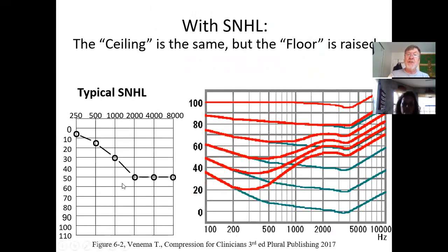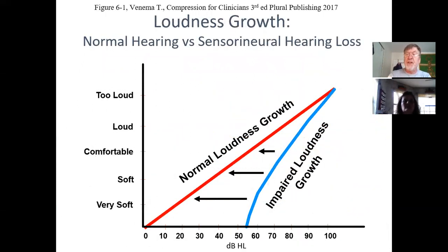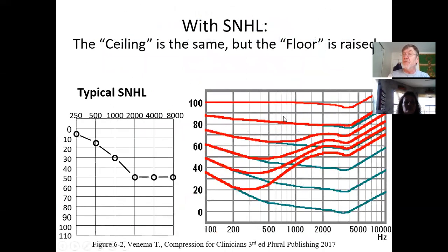And seen here too, same picture. The only difference between this picture and this picture is that this one here doesn't have frequency on it. This one does. Okay, so here's a hearing loss on the left, and here's the same thing shown in dB SPL. So this bottom blue curve is MAP.